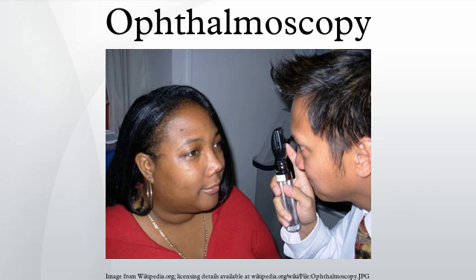In patients with diabetes mellitus, regular ophthalmoscopic eye examinations are important to screen for diabetic retinopathy, as visual loss due to diabetes can be prevented by retinal laser treatment if retinopathy is spotted early. In arterial hypertension, hypertensive changes of the retina closely mimic those in the brain, and may predict cerebrovascular accidents.